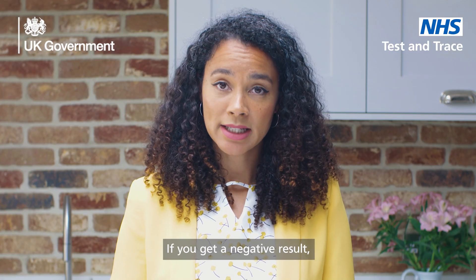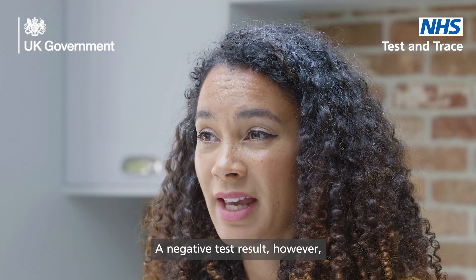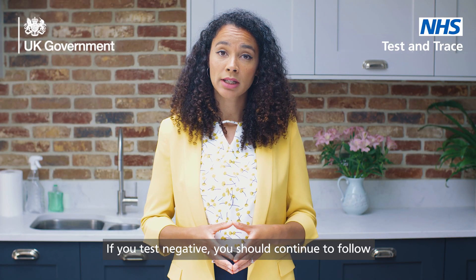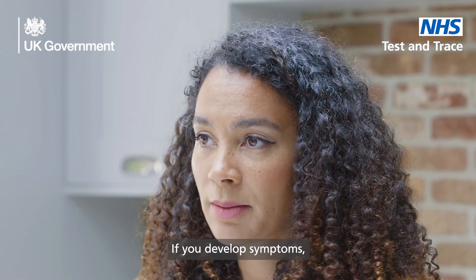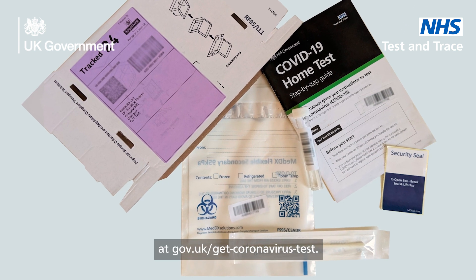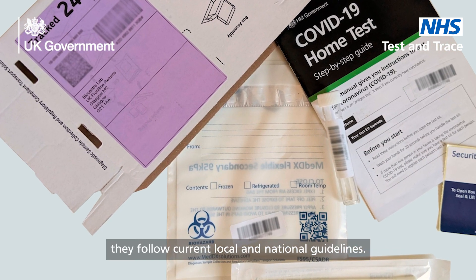If you get a negative result, it is likely you were not infectious at the time the test was taken. However, a negative test result is not a guarantee that you do not have coronavirus. If you test negative, you should continue to follow national and local rules and guidelines. If you develop symptoms, you should self-isolate and order a PCR test at gov.uk/get-coronavirus-test. Those in your household should ensure they follow current local and national guidelines.